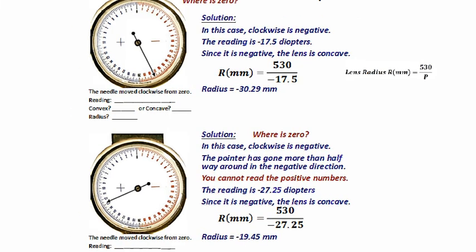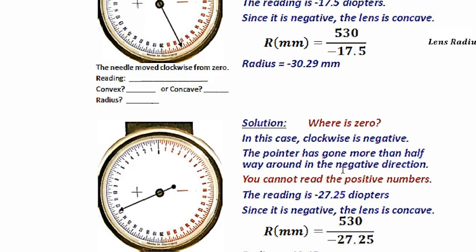So let's make it bigger, so you can see it go that way. It's a little bit difficult for us to read it. Anyway, you can see 7, 8, and then 9, 10, 11, 12, and then 13 here. We're counting from this side going this way, past 17, 18, 19, 20, 21, 22, 23, 24, 25, 26, 27, and of course we take about 25% on here.